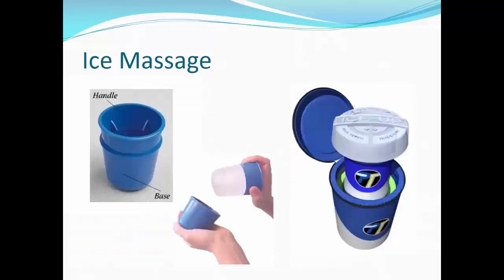Several contraptions have been created for ice cup massages. The picture on the left has a plastic handle that fits into a cup which gets filled with water. When the lower cup is separated, the plastic handle keeps the clinician's hand from being cooled, which makes it more comfortable for the clinician. The picture on the right is another cryomassage tool.